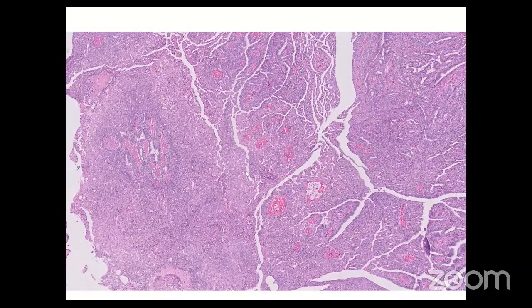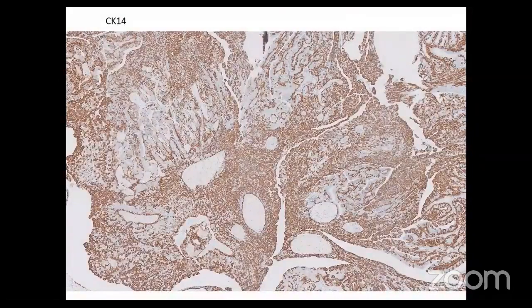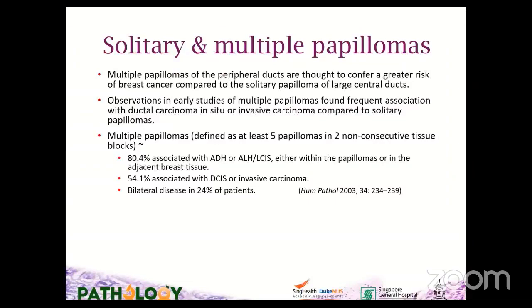Intraductal papillomas may be solidified by usual ductal hyperplasia, which is seen here as sheets of epithelial cells that efface the papillary architecture. The benign nature can be confirmed using immunohistochemistry for the high molecular weight keratin, CK14, which reveals a heterogeneous mosaic form of staining pattern within the epithelial cell population.